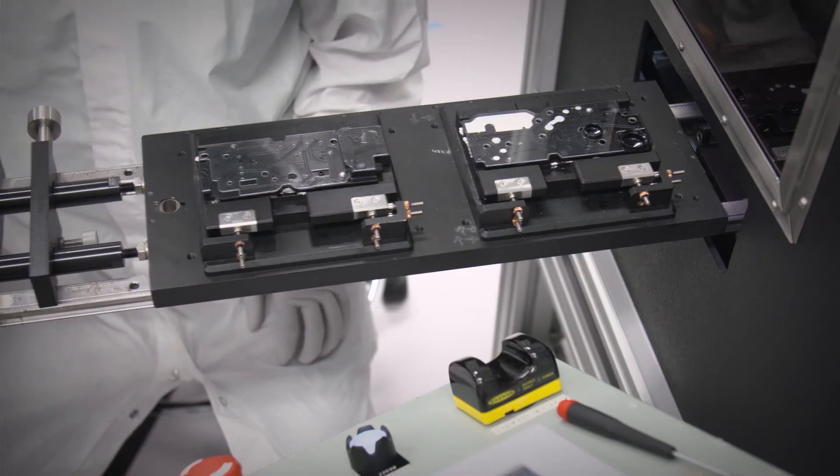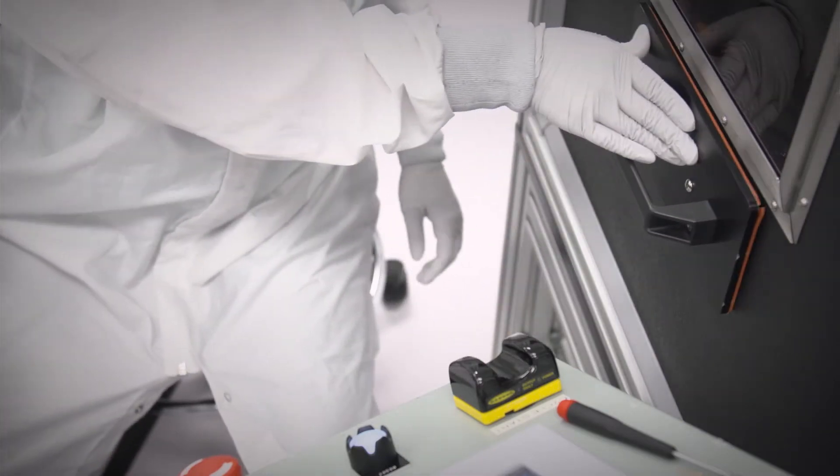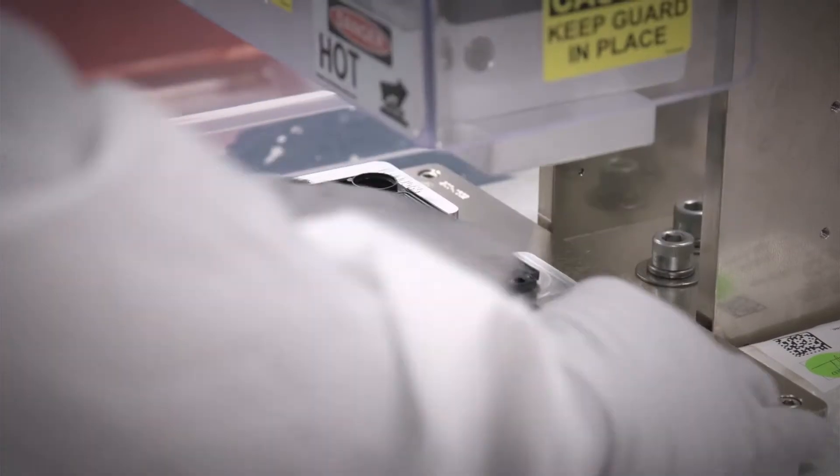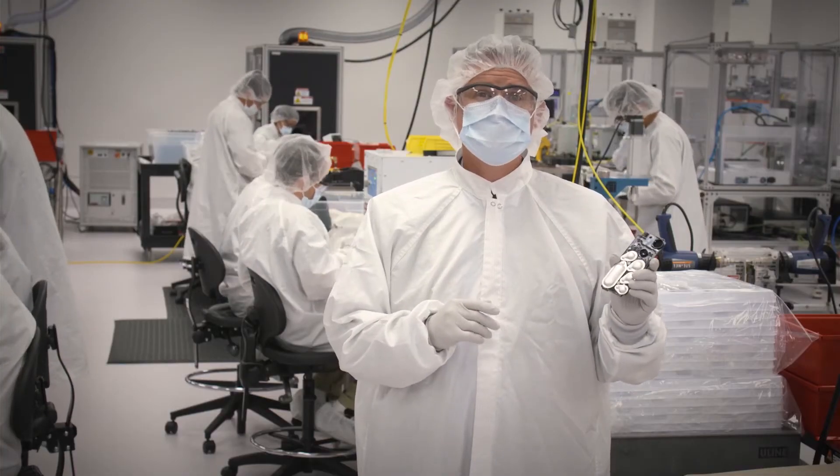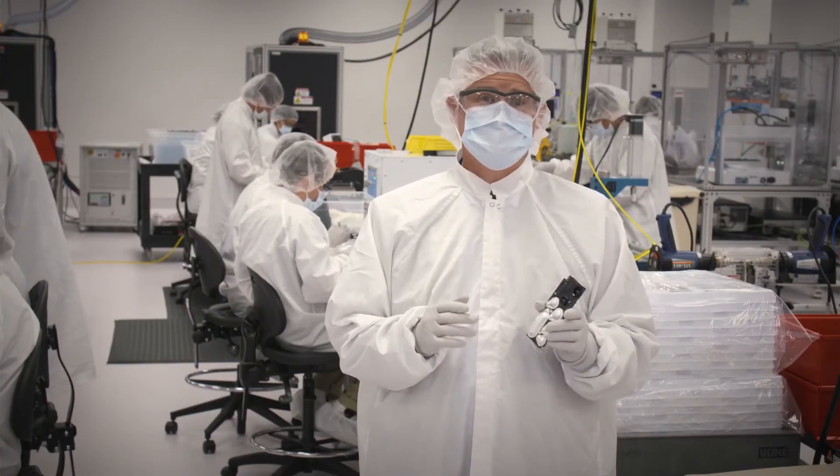The blister packs are assembled onto a custom molded plastic part that enables the dispensing of reagents based on the assay protocol. Each LRM is inspected and tested before it moves to the next step in the manufacturing process.